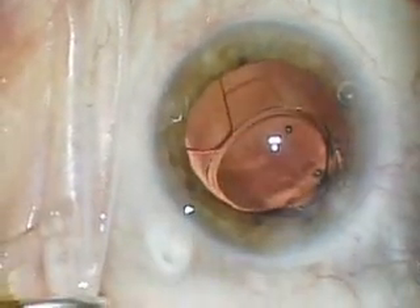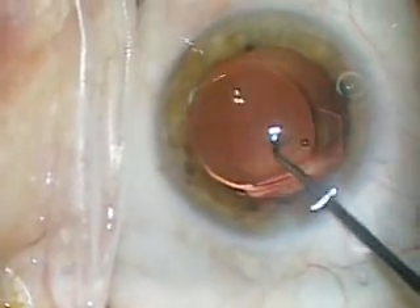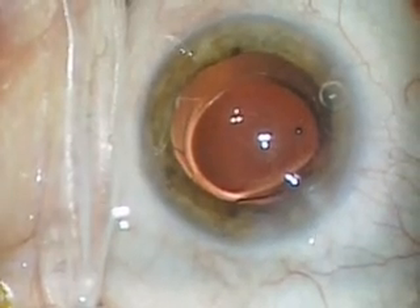It's like it's outreaching. Then it's gently tucked under the capsule, and we're done.